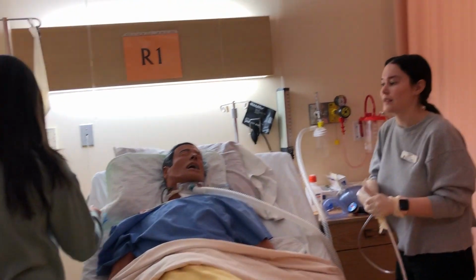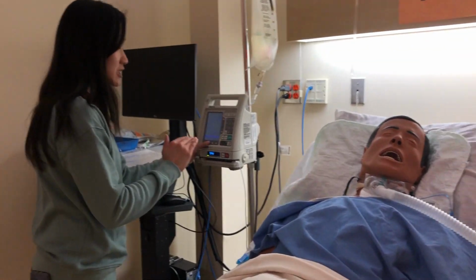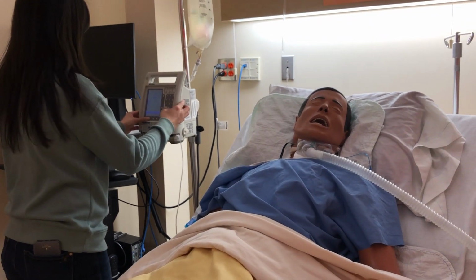It keeps beeping and then fixes itself. Okay, are you finished with this portion? Yeah, I finished with that portion of it. Okay, I'm just going to turn it off.